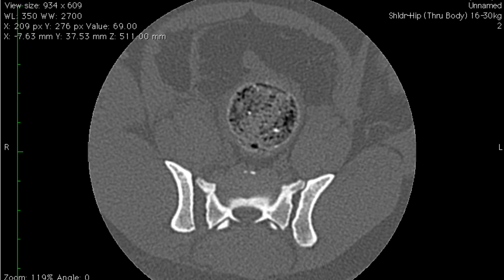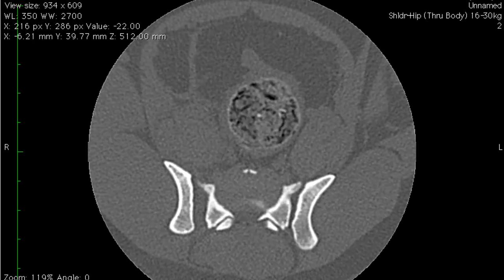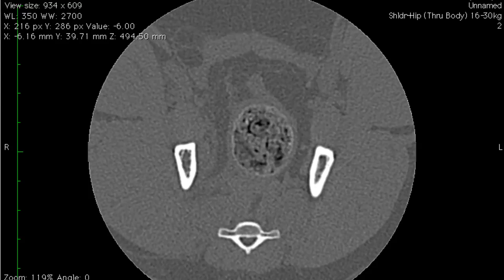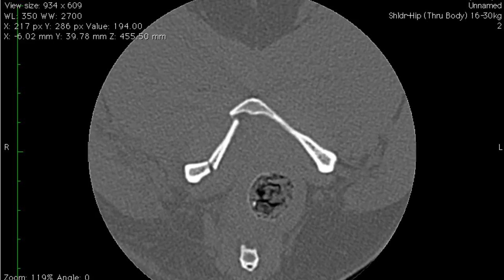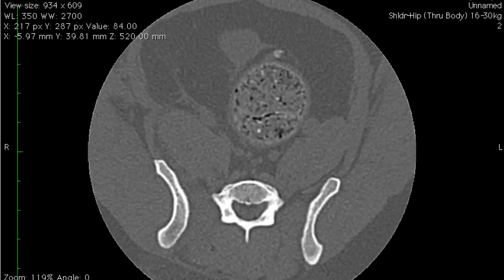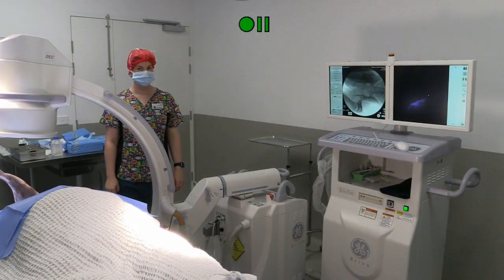Hi everyone. So I'm just going to go over the CT scan now before James repairs the SI luxation. This is a CT of the pelvis, and we can see that the left sacroiliac joint is in its normal position and the right one is disrupted and displaced. As we move back through the CT scan, we can see that there are multiple pubic fractures, and I believe there are some ischial fractures as well back here. The only one that we need to repair, however, is the sacroiliac luxation, because that's the only one that's really affecting the weight-bearing axis of the patient. So I'm going to switch back over to the camera.